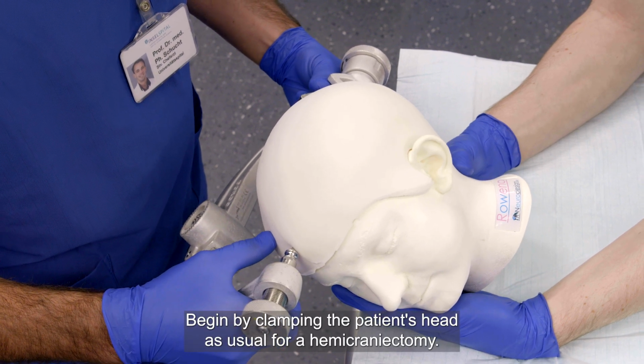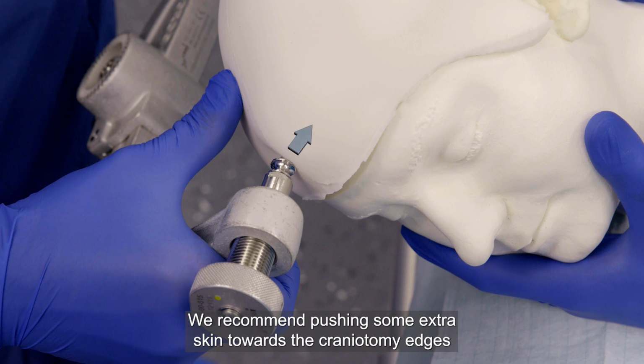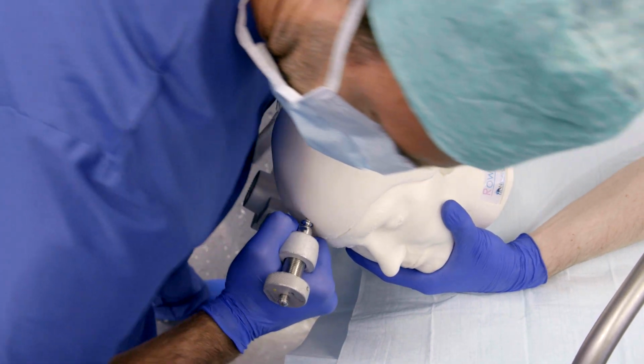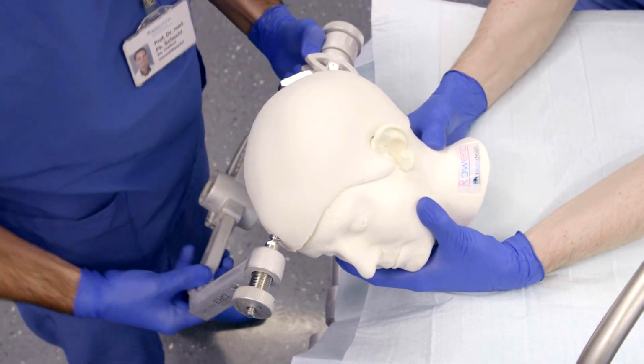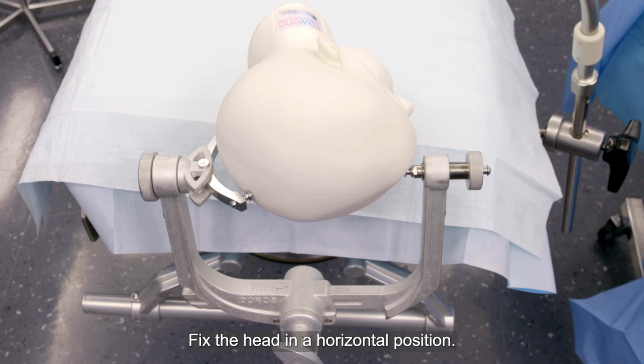Begin by clamping the patient's head as usual for a hemicraniectomy. We recommend pushing some extra skin towards the craniotomy edges to make wound closure easier later on. Fix the head in a horizontal position.